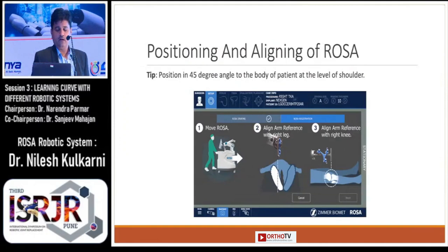After draping, the next step is positioning and aligning the ROSA. Basically, to position the ROSA you need to place it at a 45-degree angle to the body of the patient at the level of the shoulder, so as to avoid collisions. After positioning, you need to align the ROSA with reference to the knee axis.